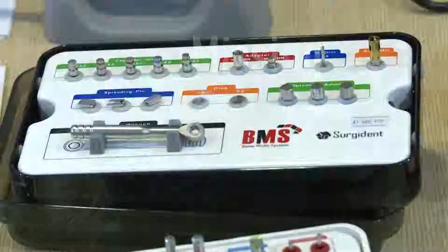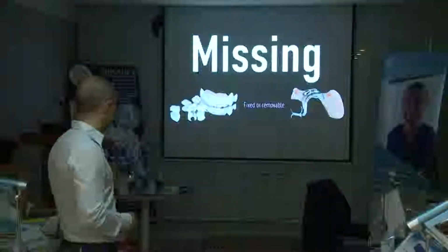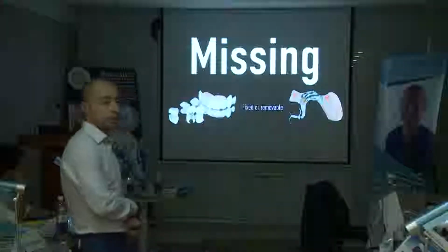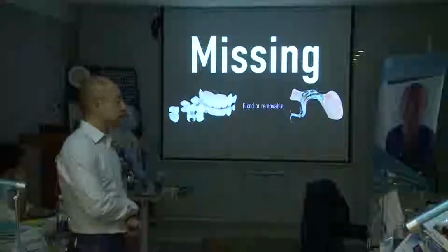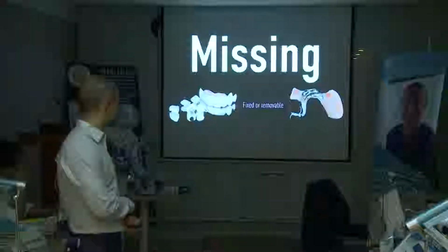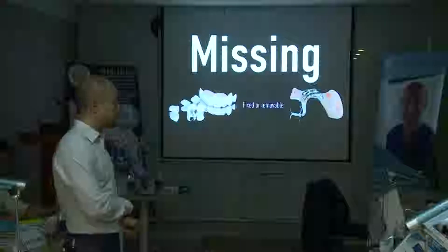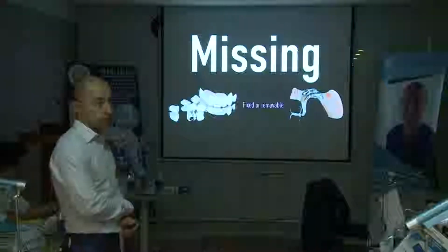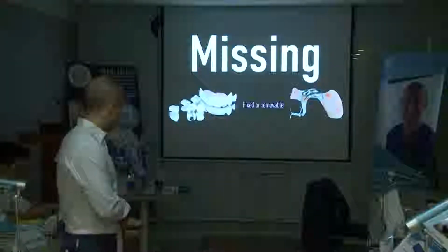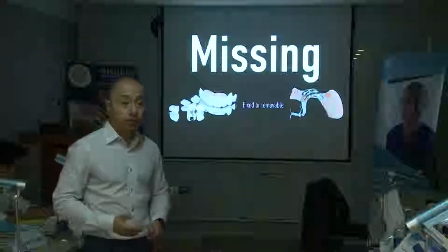Tức là đối với bệnh nhân mà muốn một hình tháo lắp thì đôi khi mình cũng có cái kết hợp với lại cái đặt implant nhé. Chẳng hạn như bệnh nhân này nếu mà mình thấy vùng răng phía trước, nếu mà cần thẩm mỹ không phải sử dụng các cái móc kim loại thì mình phải đặt 2 implant và mình làm một hình tháo lắp overdenture. Yes.